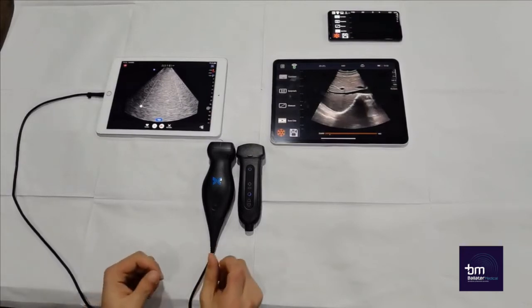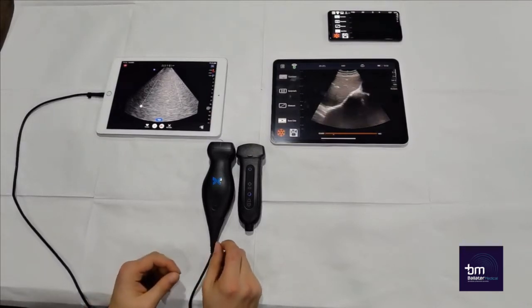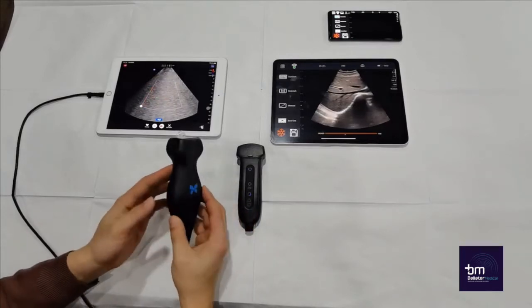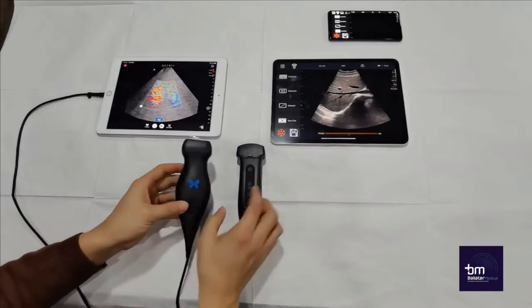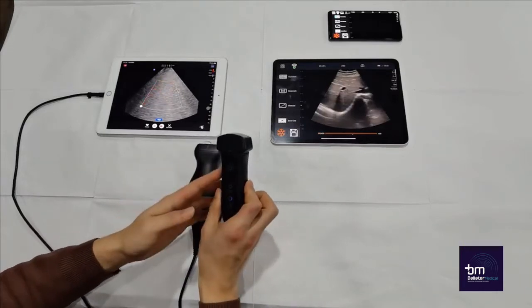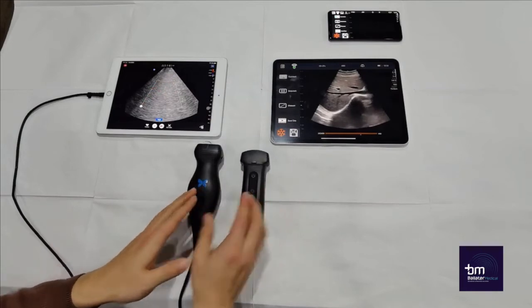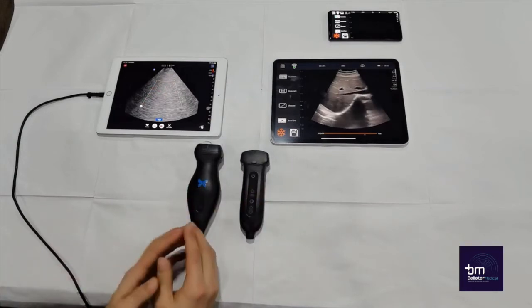Hi guys, here we have two handheld ultrasound devices that we are going to compare. The first one is the Butterfly IQ and this one is the Yuki Q7. Now let's take a look at the differences between these two models.